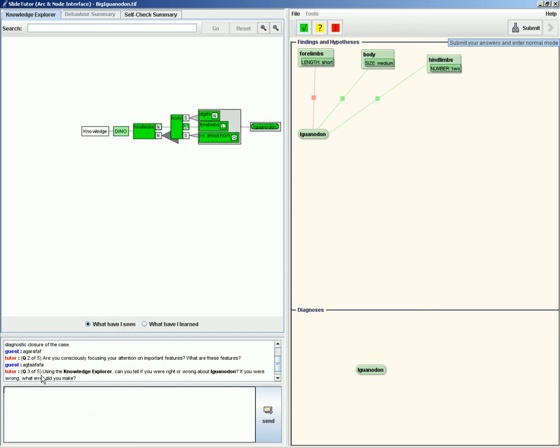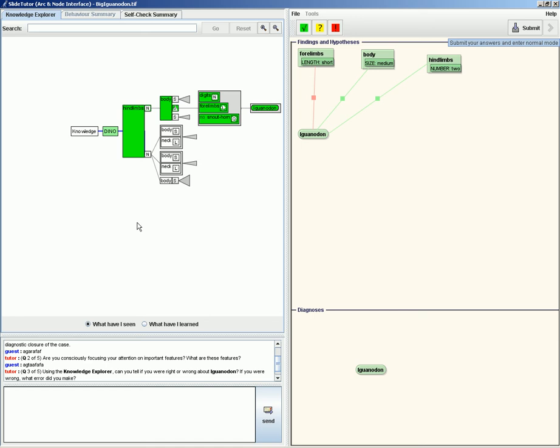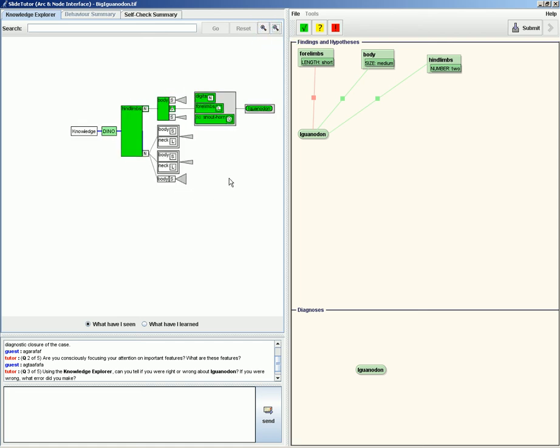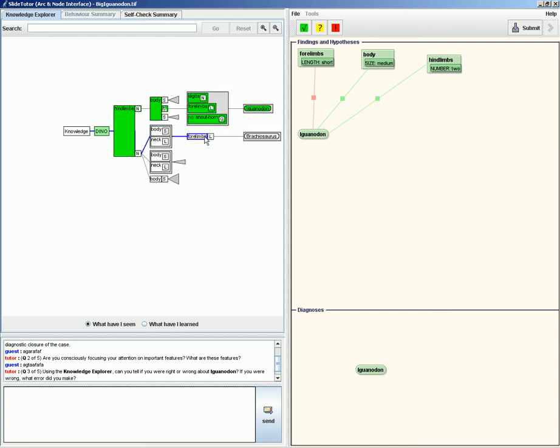now the tutor has changed. Instead of having the slide up here, I now have this tree. Now this tree shows the entire area of pathology that you are learning with the tutor. Now in DinoTutor, the tree is not very big, but in the regular SlideTutor, it's quite large, which is why we have these zoom in and out buttons up here. So that's how you can make the tree larger and smaller if you wish. And then to navigate the tree, to open and close different parts, you just click on these triangles, or to close things, you click on the preceding thing, and that will close things up.